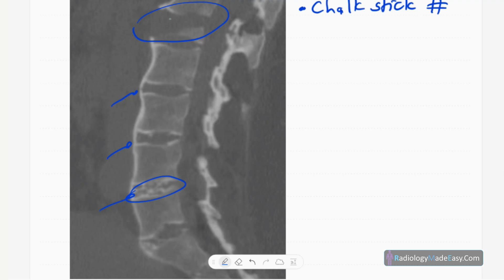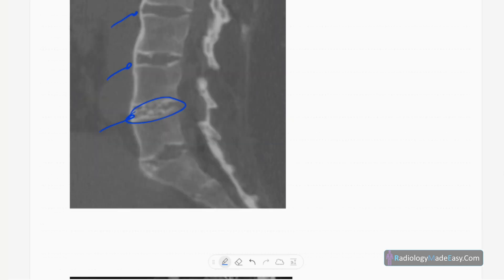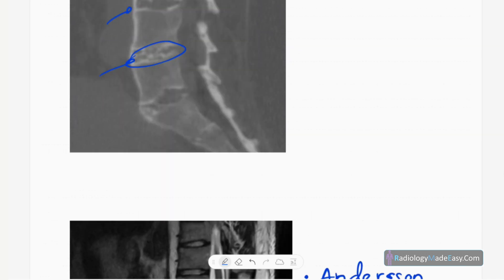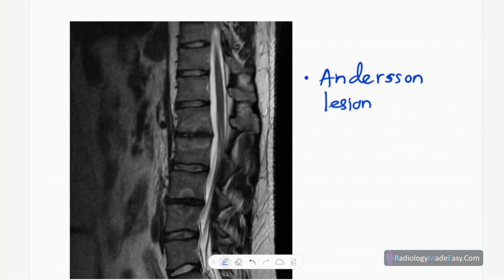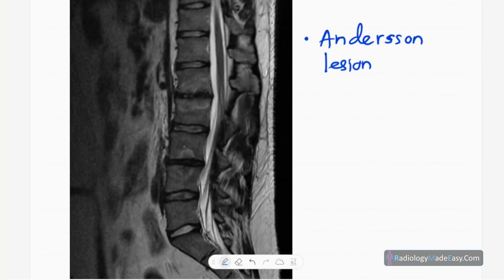Due to fusion of the vertebral bodies, fractures can occur through the vertebral body. This is another example. Now looking at MRI — T2-weighted MRI sagittal view of the lumbar and sacral spine.